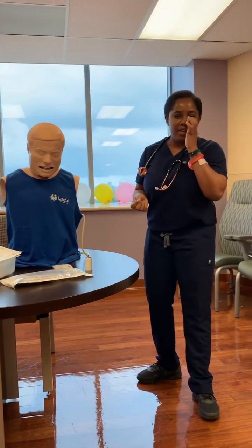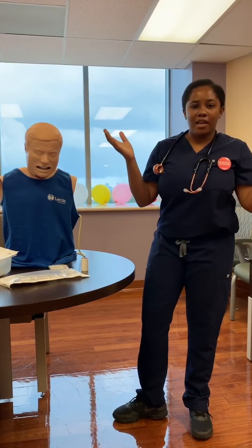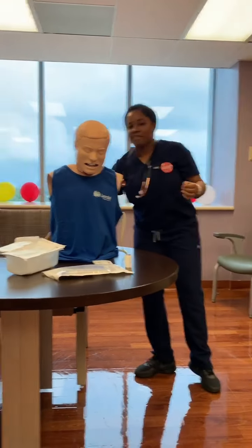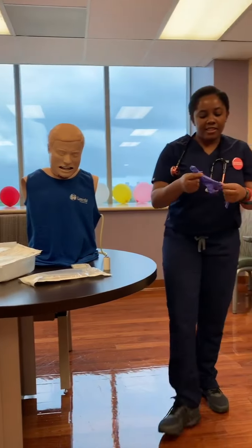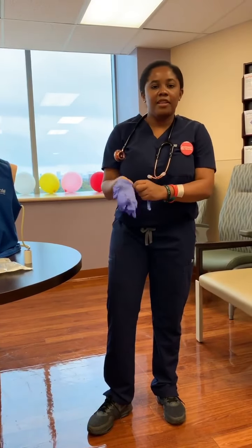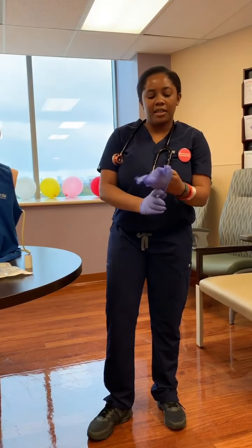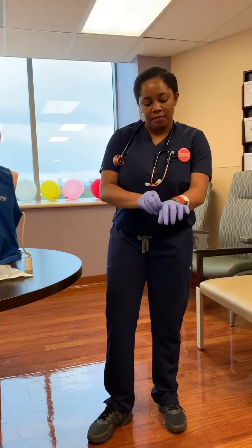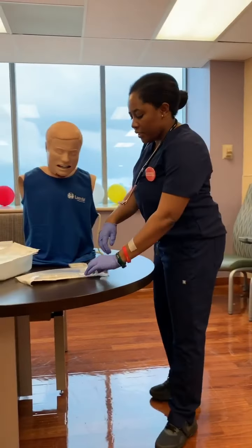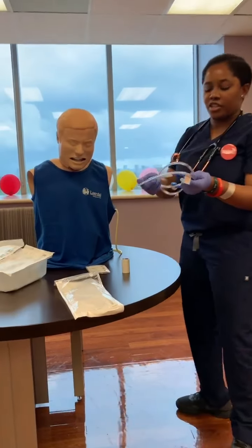With everything that we do in the interventions, just make sure that you are washing your hands first. Let's just say I already washed my hands and I do have my gloves. This is not a sterile procedure — just know the abdomen is definitely not sterile. So you don't have to worry about that, just put on some clean gloves. And the first thing that we're going to do is actually measure exactly where we're going to want the NG tube to be.